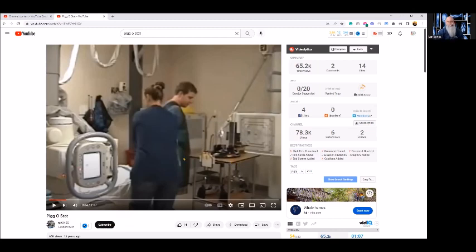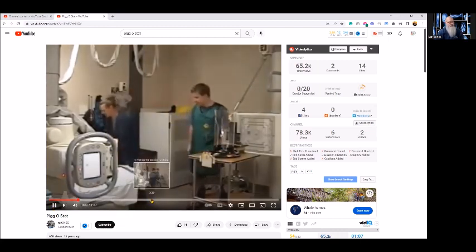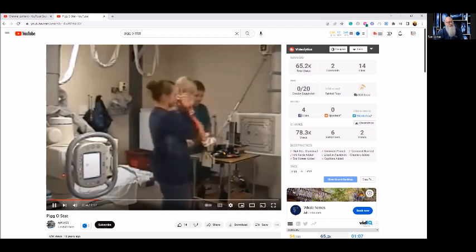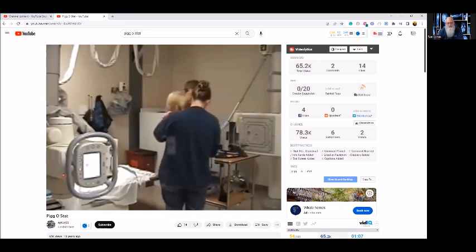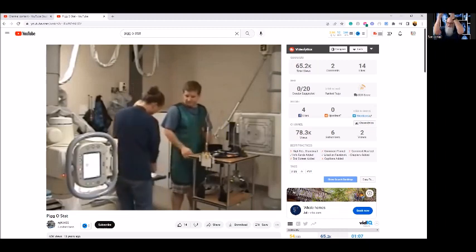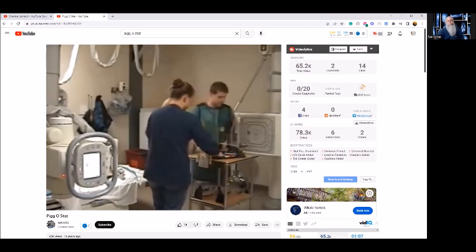And so we've let the parent up. I'm assuming this is the dad. Obviously, that's the tech. And it looks like a bicycle seat down here in the bottom. You're going to put the kid straight down in the tube, like putting them down into a tube, and the legs go around that bicycle seat, and they actually sit on the bicycle seat. And then the parent's going to hold the arms and pull them kind of taut up so that the kid's kind of elongated a little bit.